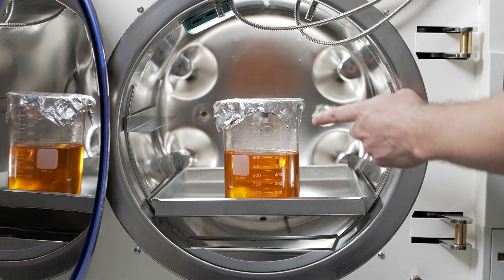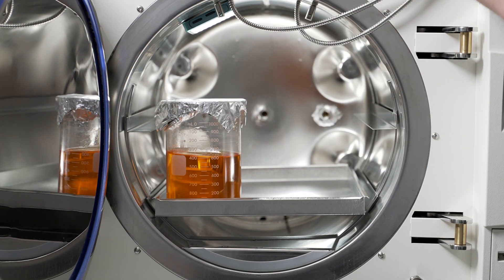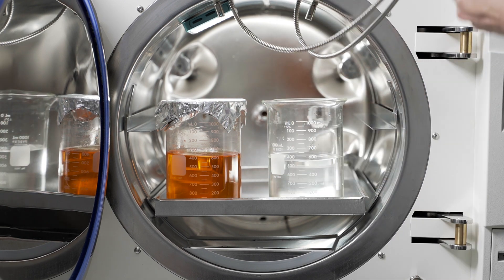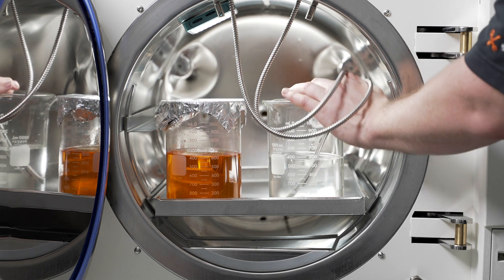If your liquid media has to be sealed or covered, please make sure to take a control vessel with a similar amount of water in it and place both the probes into that so that we can still ensure proper heat penetration on all liquid media.